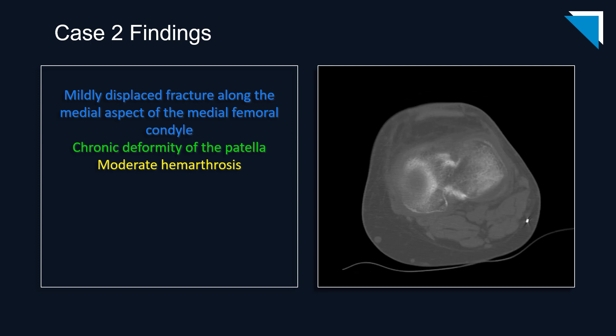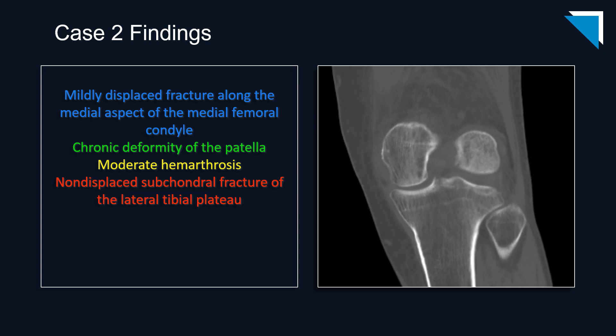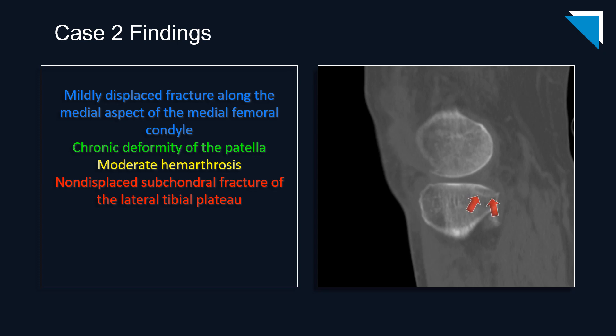If you stop there and fail to scrutinize the rest of the images, you would miss the very subtle subchondral fracture along the posterior aspect of the lateral tibial plateau. It's essentially invisible on the axial images but perhaps a little easier to see on the coronal and sagittal images. If you make your diagnosis and ask yourself before signing the report 'have I looked at everything,' you can go a long way toward avoiding these kinds of mistakes.